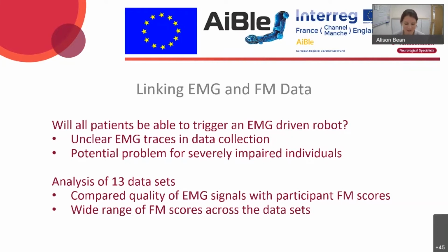So the quality of the EMG data was determined by the Portsmouth Uni team using the movement reaching from an object in midplane. The reason we chose this movement is because it's commonly used in rehab. Data may be different for other movements, but this was only a short interim analysis. So we used Fugl-Meyer scores that were collected and stratified by Hobbs Rehab staff and explored this alongside the EMG signals.